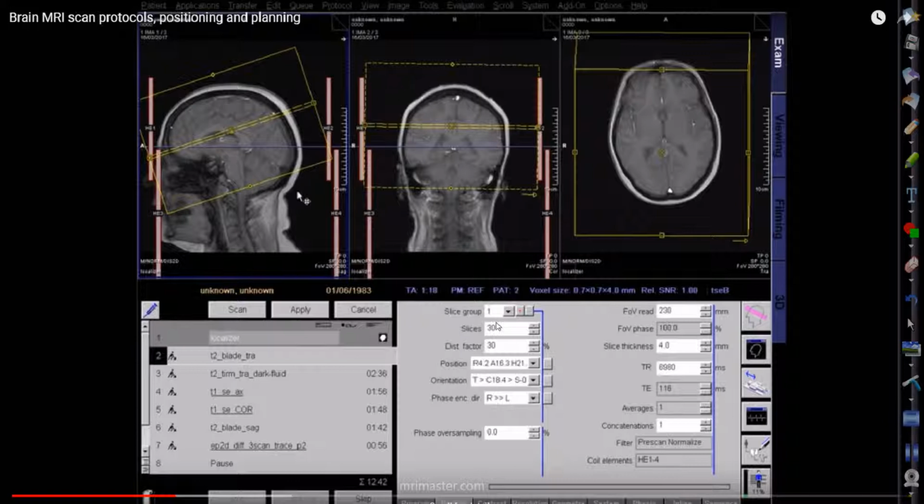What else on here do we recognize? Slice thickness. Where do you see that? On the right side. Good. Slice thickness, that's determined by what? Slope of our slice select gradient or our transmit bandwidth, right? If we have a narrow transmit bandwidth, we get a thin slice, which would equal like 3 millimeters. If we get a wide one, we get a larger slice, which is 5 millimeters typically.